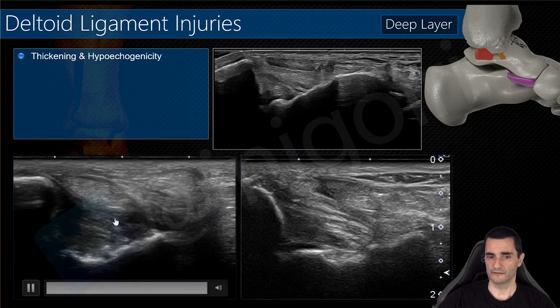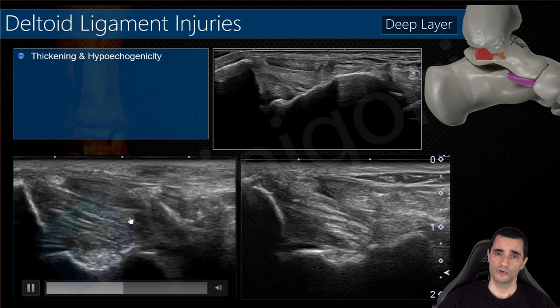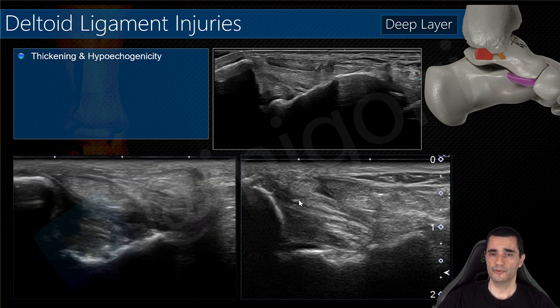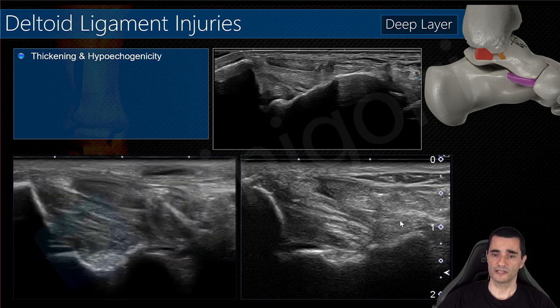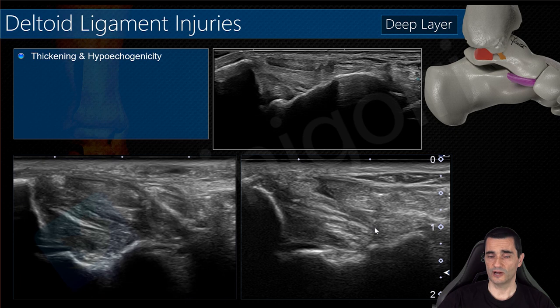Compare with the normal side — if we compare with the normal side, we can see the thickening and the hypoechoic ligament. When you are beginning with ultrasound, always compare with the contralateral side if you have doubts.